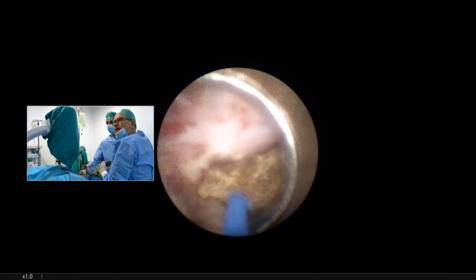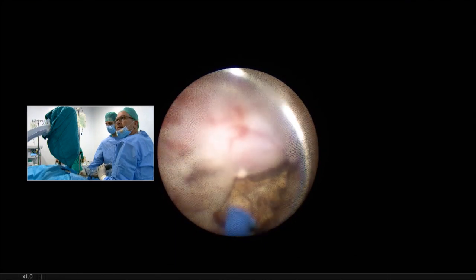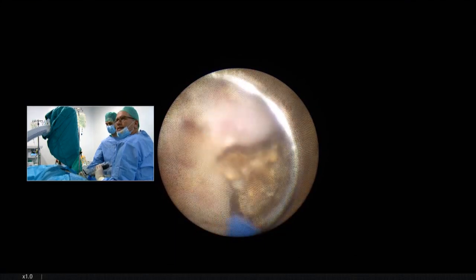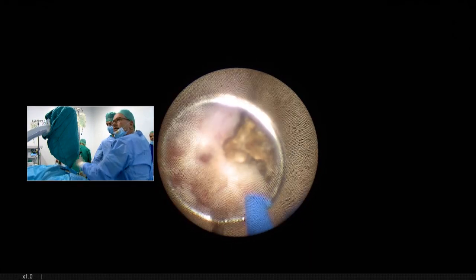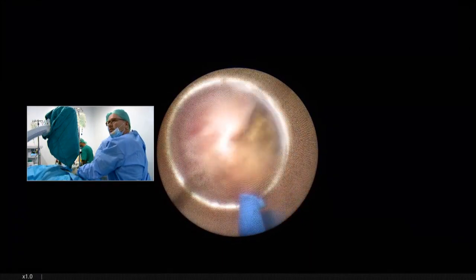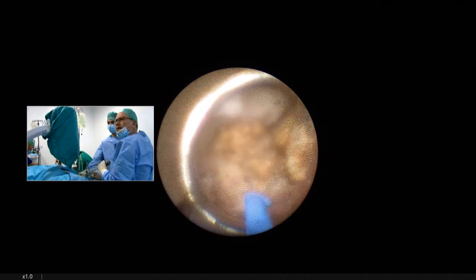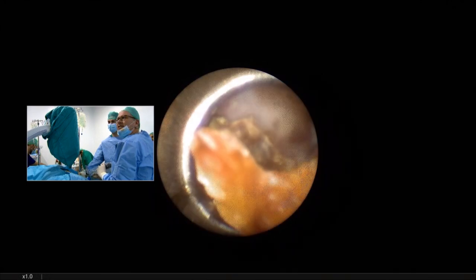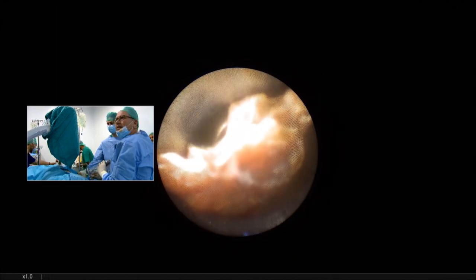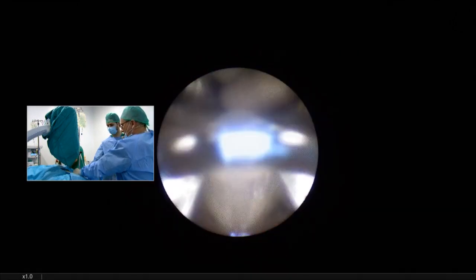Okay, we have a little success. Yes, we are seeing this. It's very good. It takes a little time. Yes, but of course. Doesn't matter. Like you have said previously, it needs a lot of patience. And stones are coming automatically, toward the Amplatz sheath. Yes, it's good. This can be seen clearly.